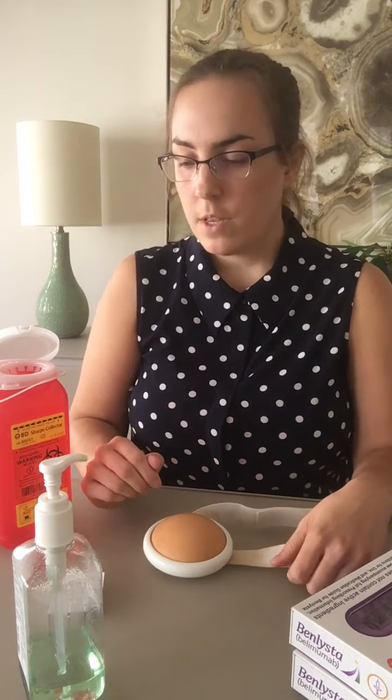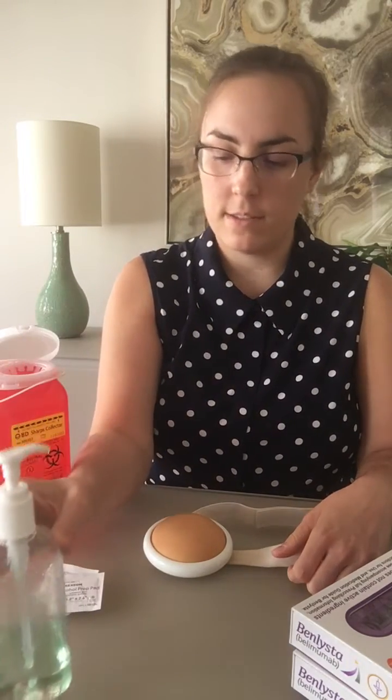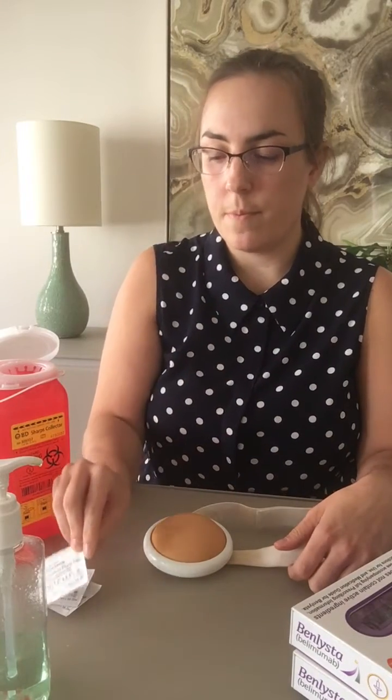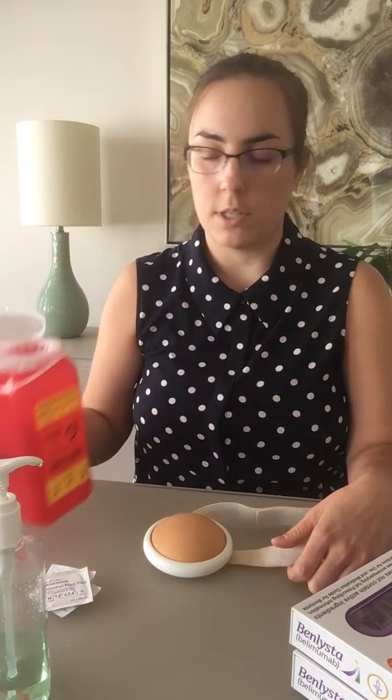First things first, whenever you inject any medication, you want to make sure that all your materials are available to you. You're going to want something to wash your hands, something to clean the skin — so an alcohol swab — and something to dispose of the medication, so a sharps container. And you're going to want your medication.